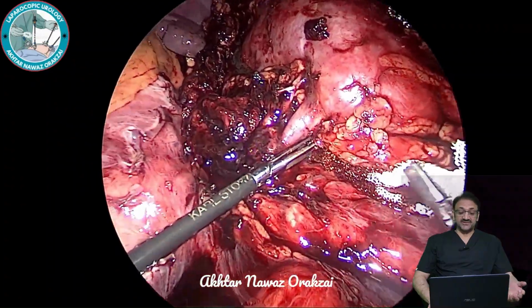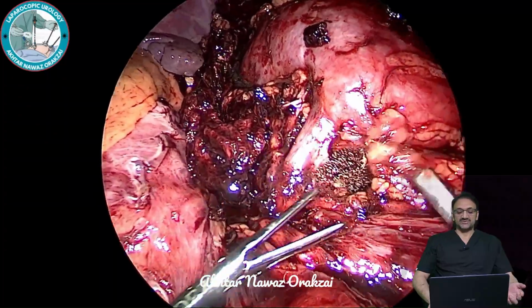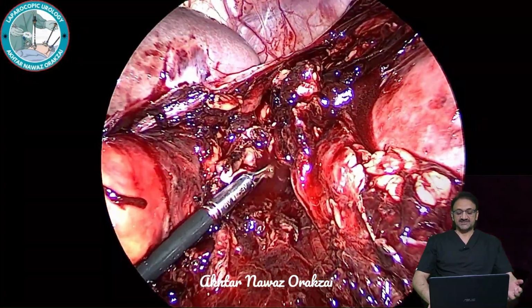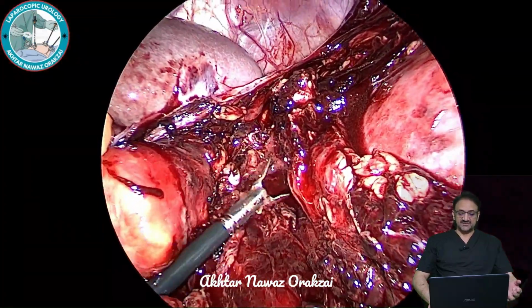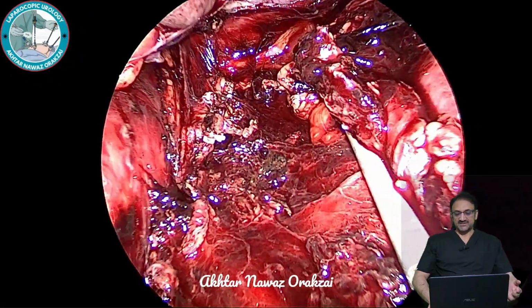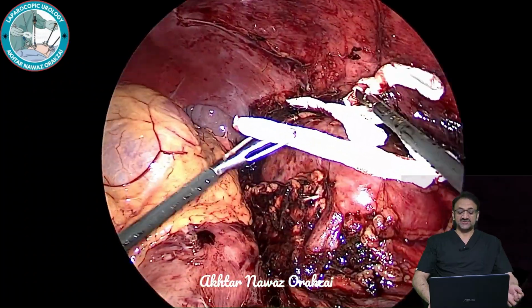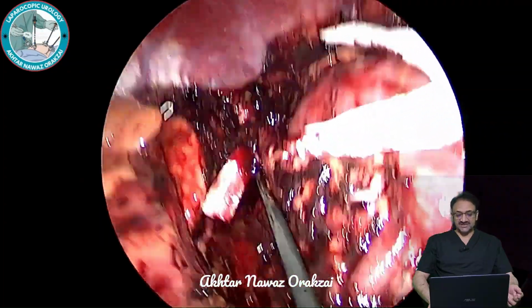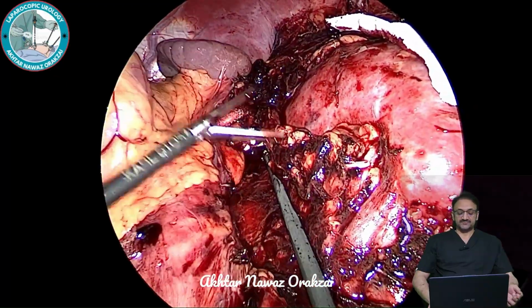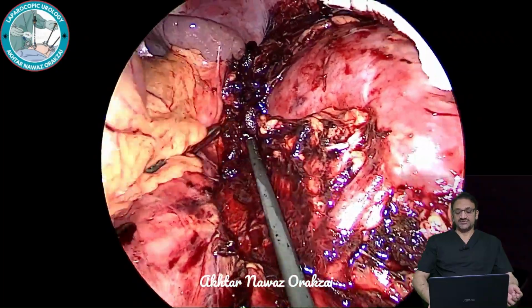Post-operatively, so here you can see that we are applying Surgicel, the Spongeston, and some more Surgicel. After washing the area thoroughly and suctioning it, and then seeing no major vessel was opened, there was no major bleeding. So a lot of small bleeding spots, they have been coagulated with bipolar, and then we will fill this space with the hemostatic agents like Spongeston and Surgicel. And then we will place a drain and cover the kidney with repositioning of the gut.